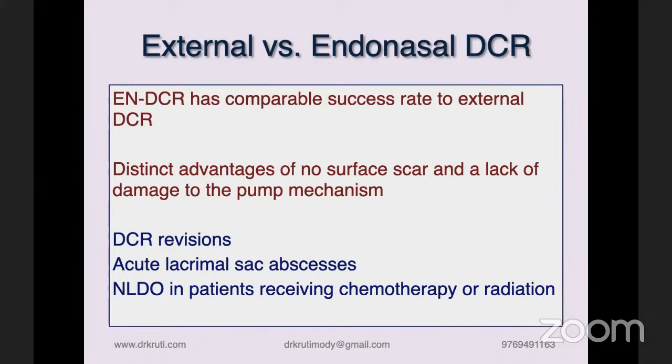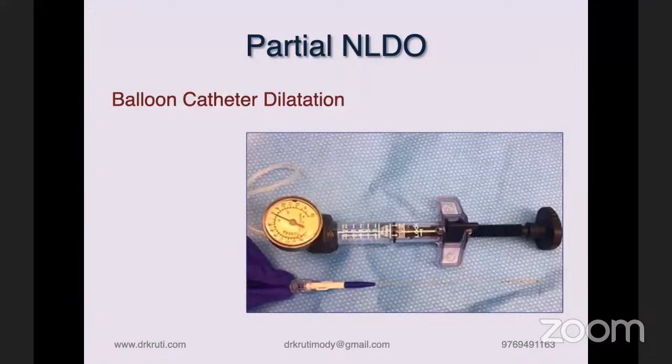NLDO in patients receiving chemotherapy or radiation: you prefer endonasal for these patients. Now, if you have a partial NLD obstruction, the modality is a balloon catheter dilatation. Now, if your partial obstruction is more than 50-60%, please go and do a full-fledged DCR. Balloon catheter dilatation is for lesser obstructions, but where the patient is still symptomatic.